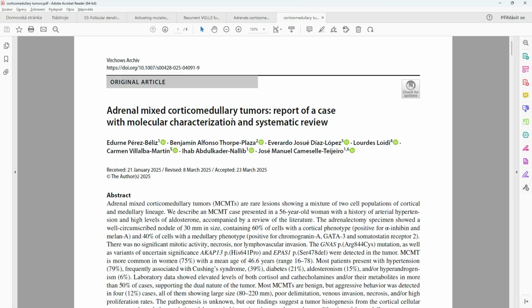It was just published in press, adrenal mixed corticomedullary tumors of adrenal glands. There is actually a tumor that has admixed cortical adenoma on one side and pheochromocytoma on other sides, and they grow, it permeates one into another. Yeah. Is there some picture?